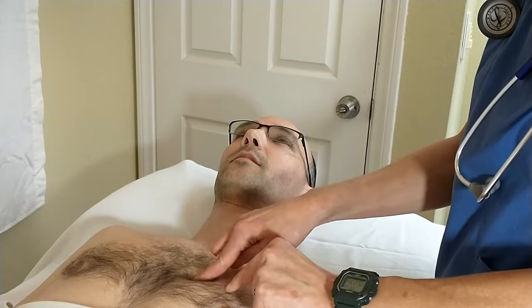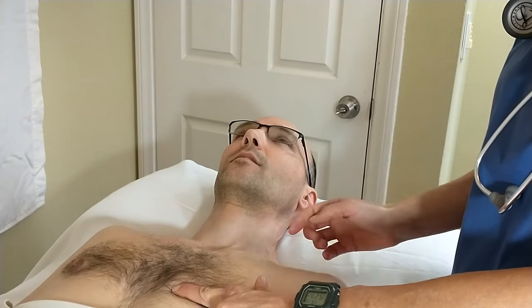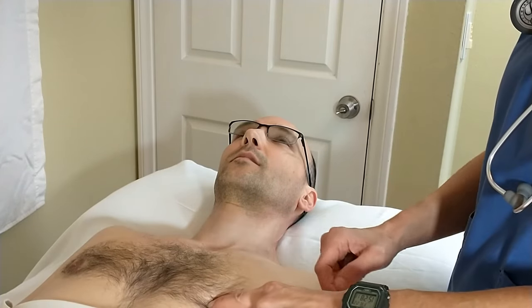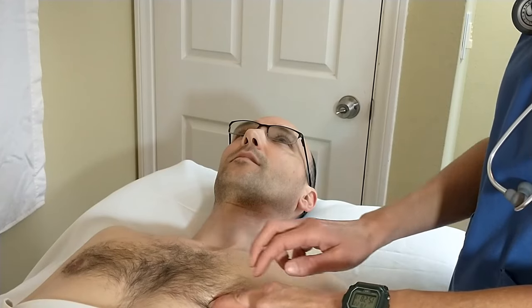So here is my second rib and then I find my second intercostal space, then my third rib and my third intercostal space, my fourth rib and my fourth intercostal space, fifth rib and fifth intercostal space. So now I know that horizontally here I have the correct line. And then regarding the vertical assessment, I'm looking at the midclavicular line. So again, I'm looking at the clavicle and right in the middle of it, approximately here, I run it down and I find the axis between the two. And so here I have my PMI.